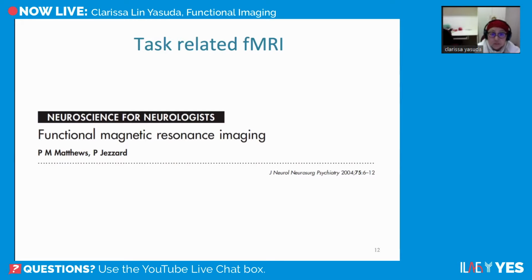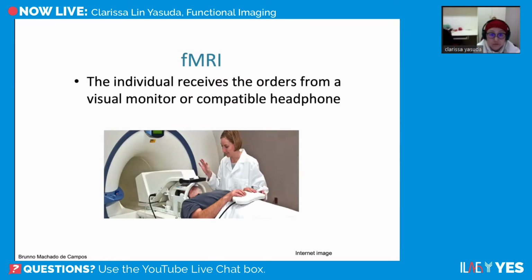So what is task-related fMRI? I think it's a nice paper, exactly our scenario. It's neuroscience for neurologists, and it talks about functional magnetic resonance imaging working for the clinical scenario. I think it's a nice reference for you to have.